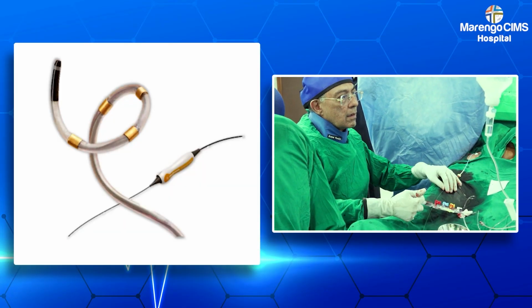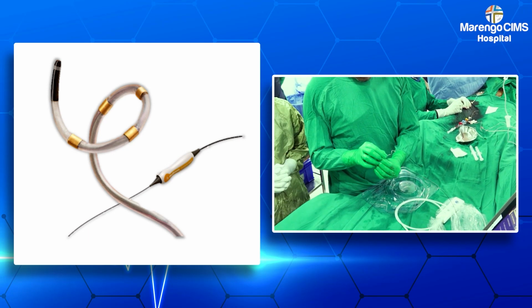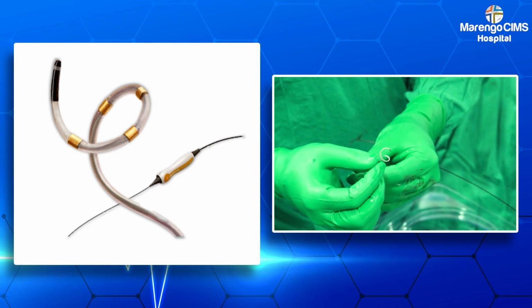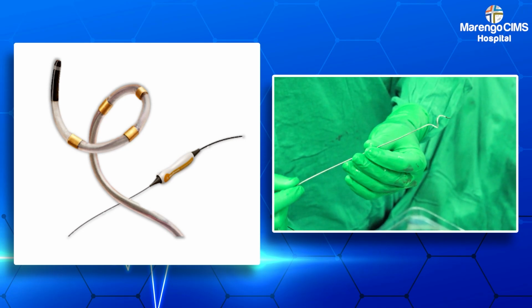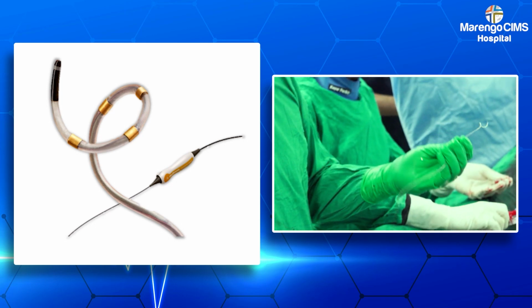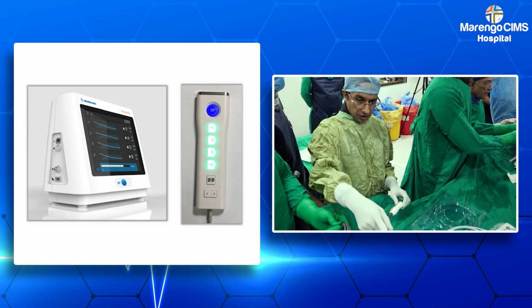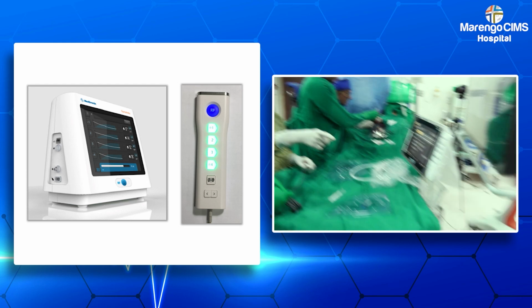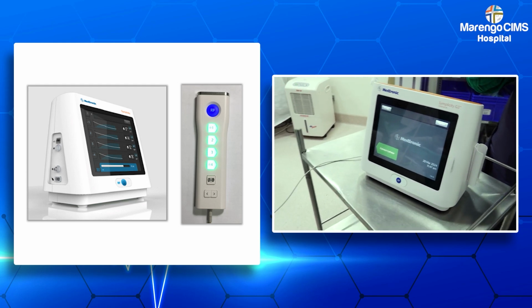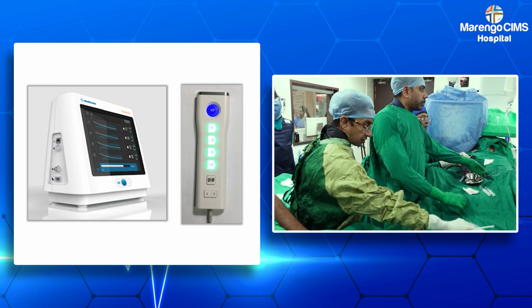So this is Medtronic Symplicity spiral catheter, and you can see the electrodes at the tip of that curved spiral catheter, which we will introduce over the wire, 014 wire, and that will go inside the renal artery and deliver the radiofrequency shocks. So this is the catheter back end. This will be connected to the console there, with which we will be giving the shocks of the ablation. There is also a remote here, which you can see either we can give through the console or through the remote.